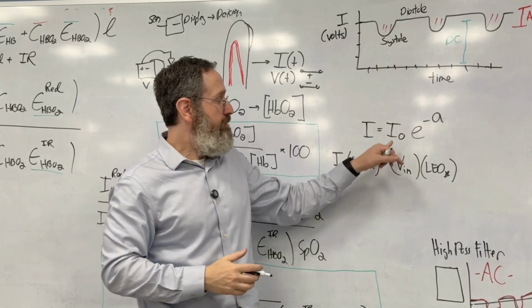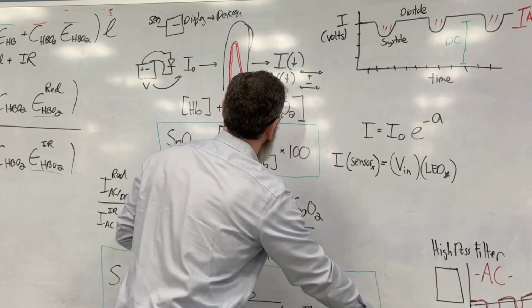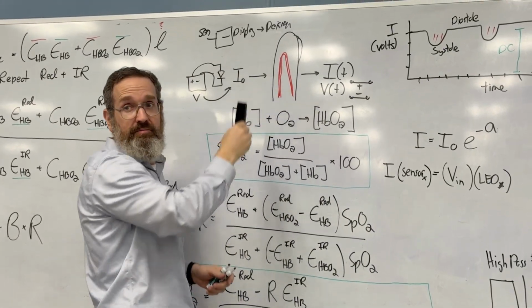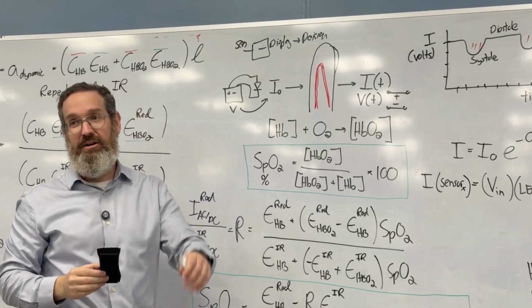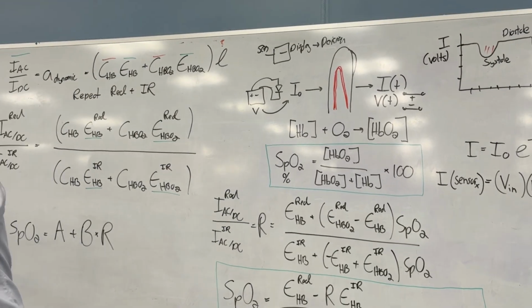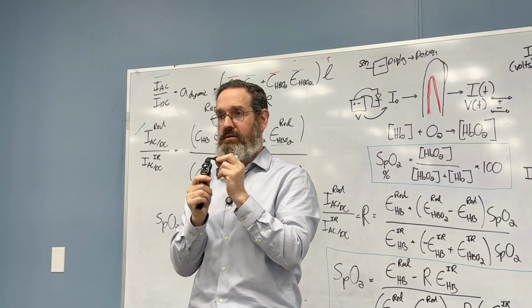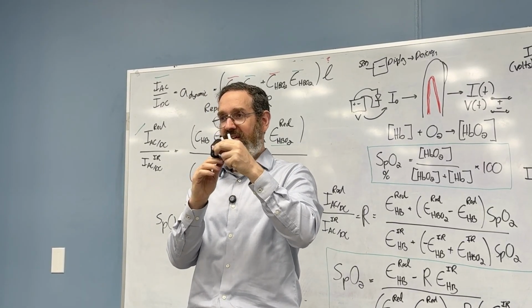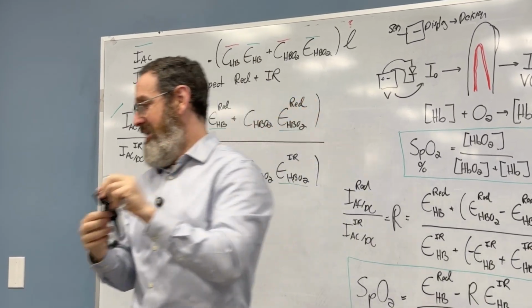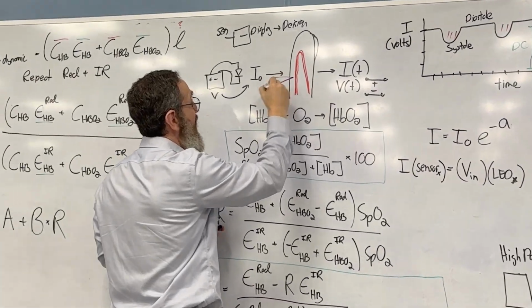Interesting. Now it turns out there are other issues as well. This assumes that the sensor is right here and the emitter is right here. It doesn't work that way. Not only that, but in this device the sensor and the emitter are on the same side. Apple couldn't put the sensor on this side. I think it would have been complicated with the band, which means the light goes in and then it comes out. So it's not what I showed you like this. The light actually goes in and then it bounces back.